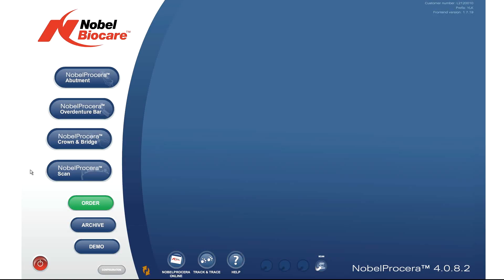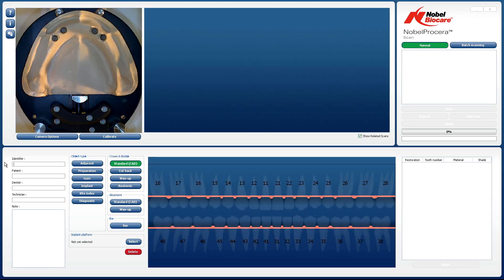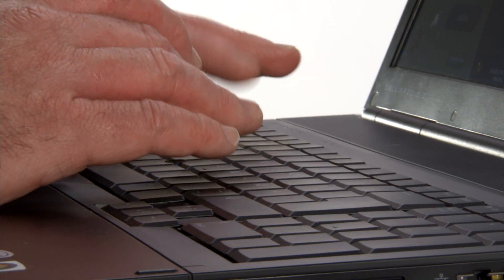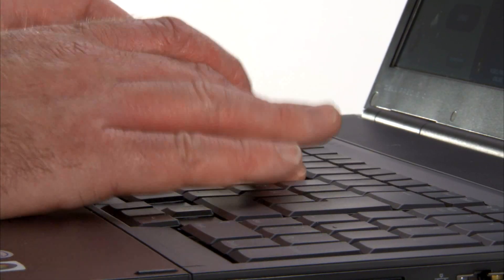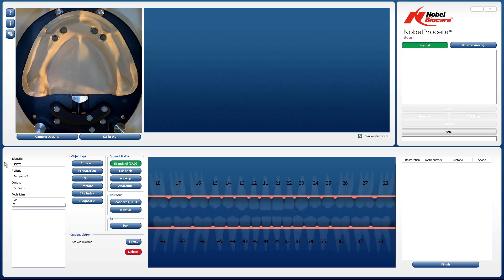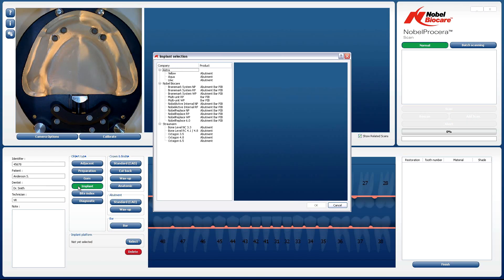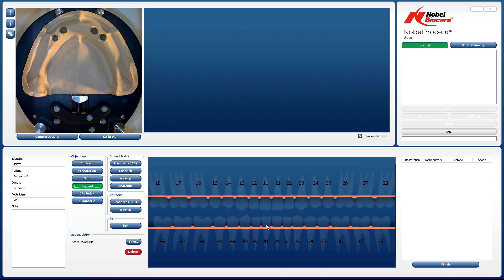Left-click on the Scan button in the Nobel Prisera software. Start by filling out the case information. Left-click on Implant under Object Type. An implant select box will then appear. Choose the correct implant platform and size and then click on OK. Select the implant positions in the tooth chart that represents the correct tooth positions on your model by left-clicking with your mouse.